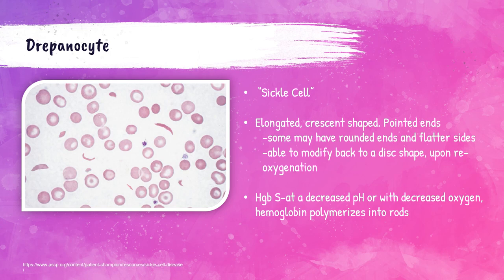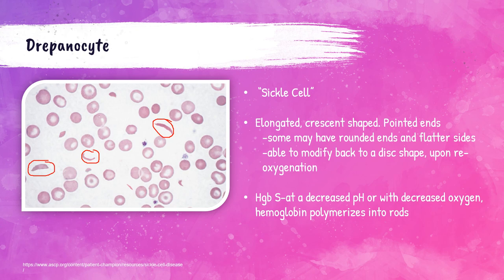Drepanocytes, or sickle cells, are thin, elongated, crescent-shaped red blood cells with pointed ends. These cells contain hemoglobin S, which is an abnormal hemoglobin type, and are seen in sickle cell disease and sickle cell trait. These red blood cells polymerize into this shape when there is a decrease in blood pH or a decrease in oxygen. They're frequently seen with codocytes, which are also called target cells. This is a great example of a drepanocyte or sickle cell, and here's another one. I also mentioned codocytes — this is an example of one, and it literally looks like a bullseye right in the center.